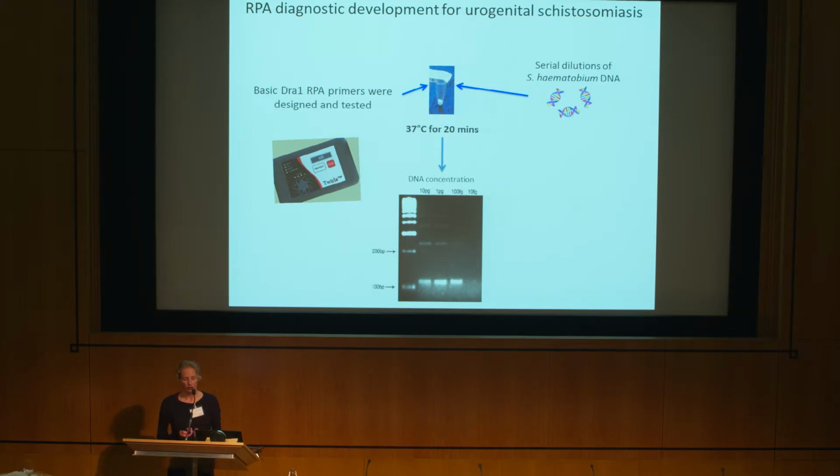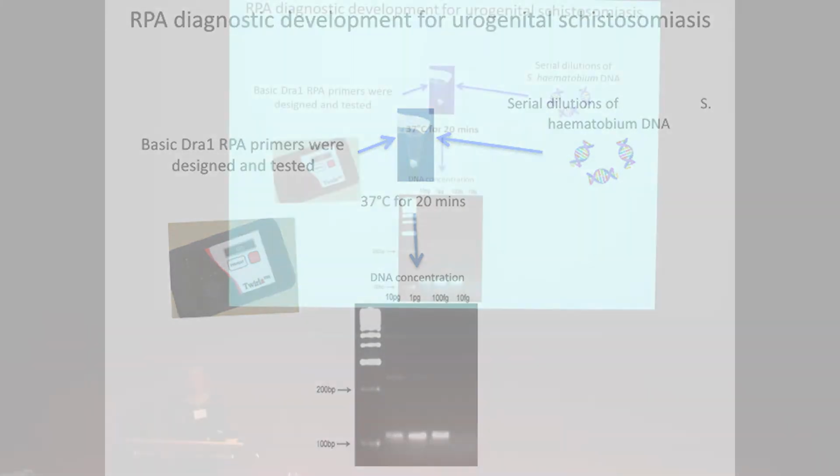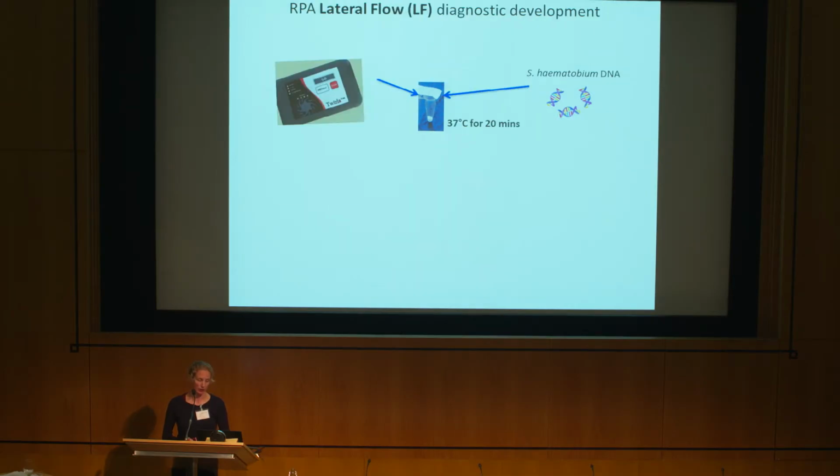We analysed it through gel electrophoresis, and the assays worked. So the reaction takes 20 minutes at 37 degrees in a portable handheld device. And you can see on the gel there, we're getting down to 100 femtograms of DNA. So sensitivity was very good.